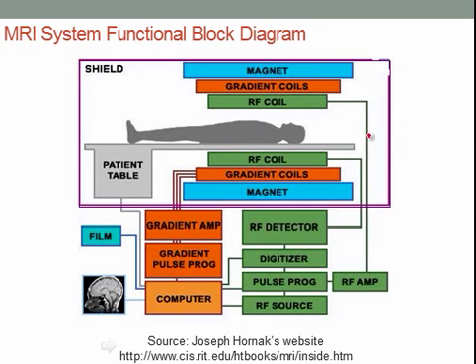So he's showing here the magnet, of course, and the gradient coils. He also shows the RF coil. As you remember, we talked about the RF coil in the last topic. Some machines have a built-in RF coil, right in the bore. This is called a body coil. While the coils that you would place, for example, around the brain here, would be a receive coil. Some machines don't have this built-in RF coil, but I believe most newer clinical machines do.